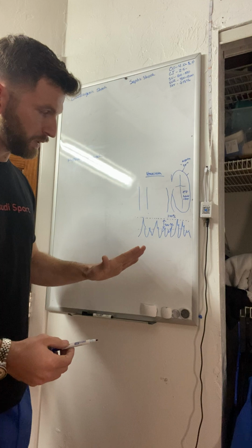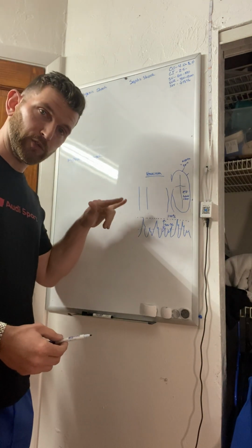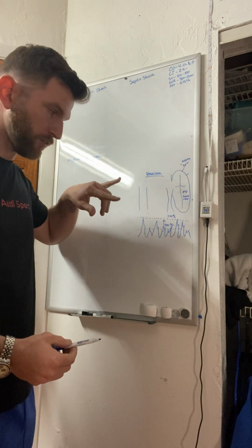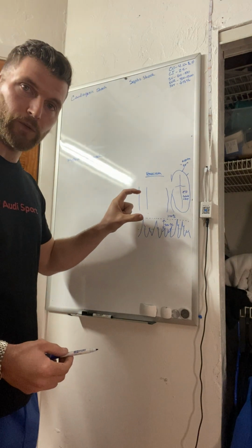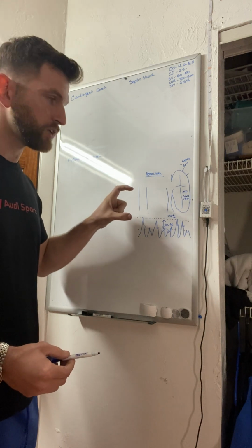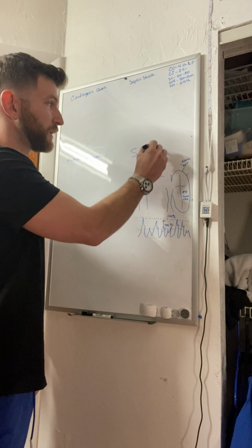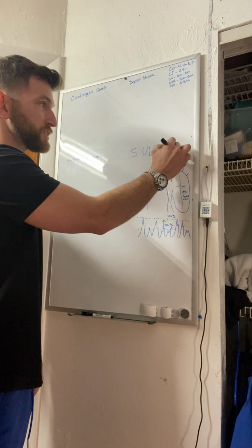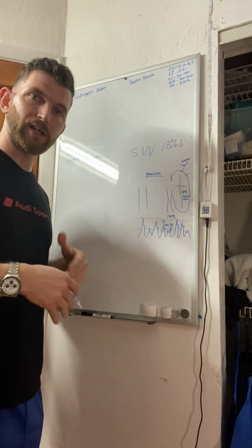And the next beat being shorter is a smaller volume. The difference between the two volumes is the variation of the volume. Now, as that gets greater, you have a higher percentage of change. That's measured as SVV. So SVV is usually 13% variation or less. We're okay with that. That's normal.